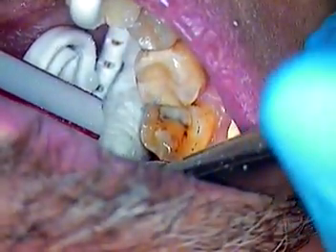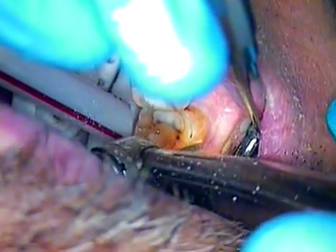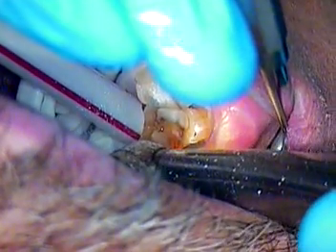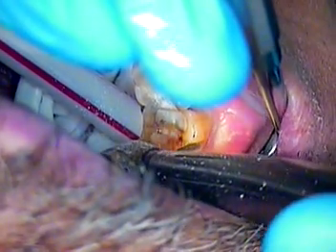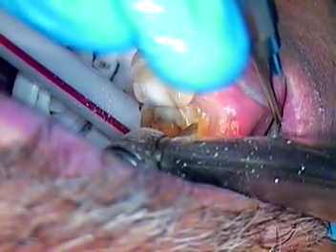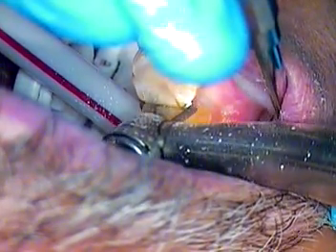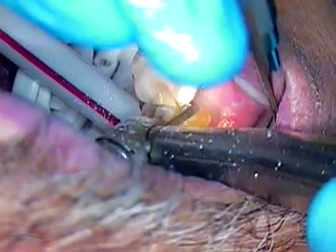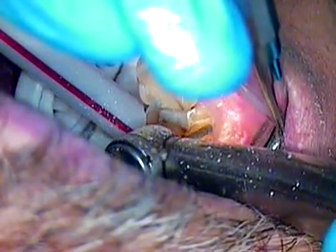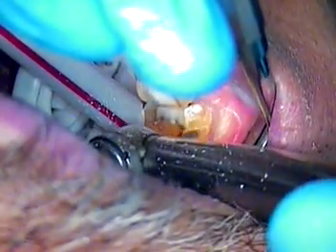So depth cuts for vertical. I'm going to use a small mirror on the buccal just for retraction only. Come right through the buccal groove for 31. You're dealing with four cusp anatomy. And I'm going to go the depth — half the depth of the toe of the burr for my margin. And I'm hawk-billing that in. You can easily keep the margin above the gum line. You don't have to go below or even at the crest. So as you get toward the occlusal portion, you're going to go a little deeper. So I'm half the diameter of the burr at the margin, and as I get toward the occlusal, I'm going to be almost the diameter of the burr itself.